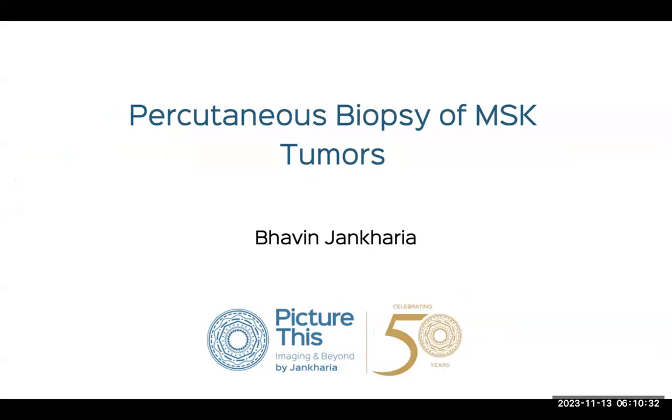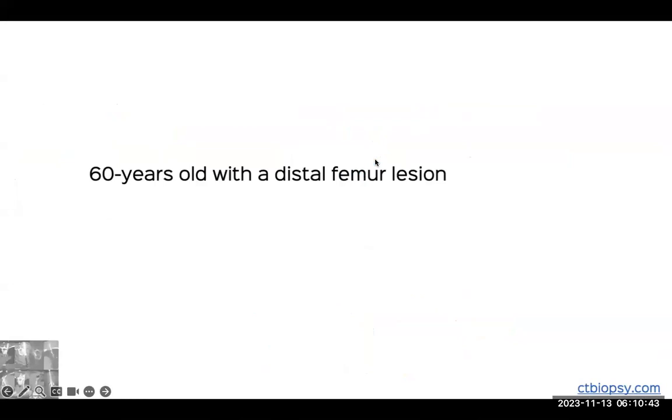Hi. I gave this talk recently at the International Cancer Congress, and I thought I'd just share this with you. This was an approach to percutaneous biopsy of MSK tumors. And let's just start straight off.